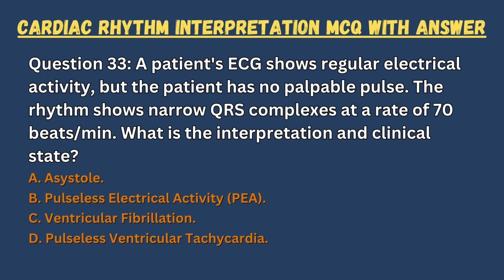Question 33. A patient's ECG shows regular electrical activity, but the patient has no palpable pulse.